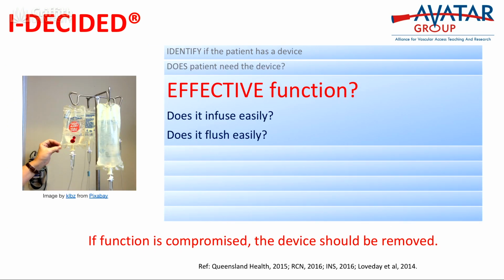The next question is E, effective function. Does the IV still actually work? Does it infuse easily? Does it flush easily? If function is compromised, the device should be removed.